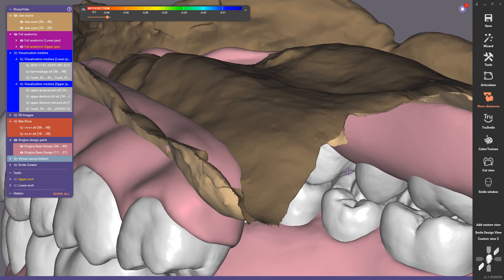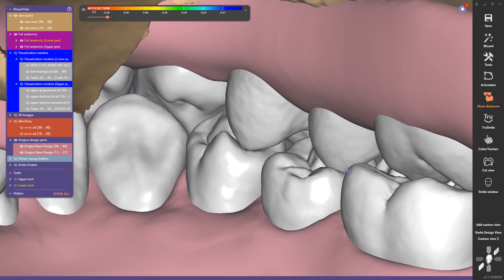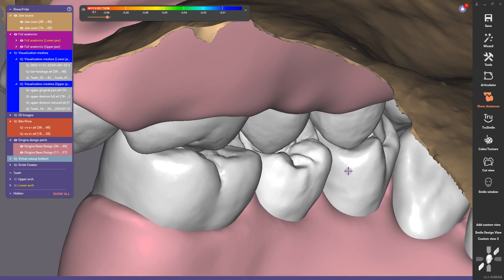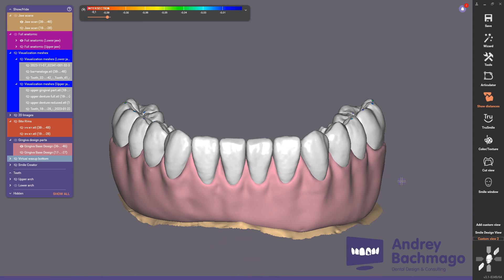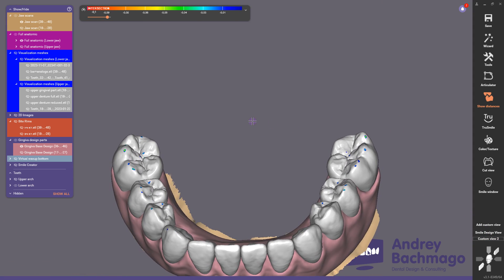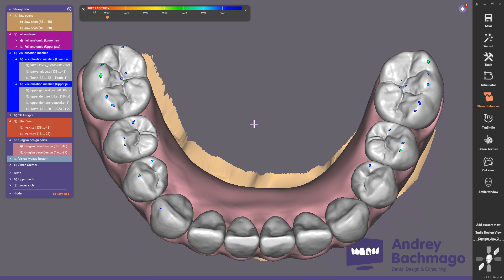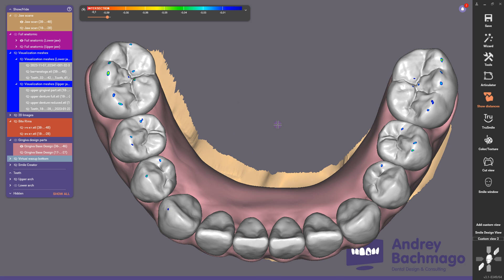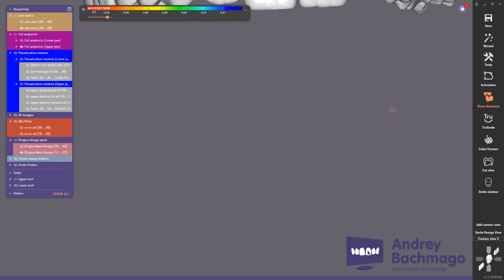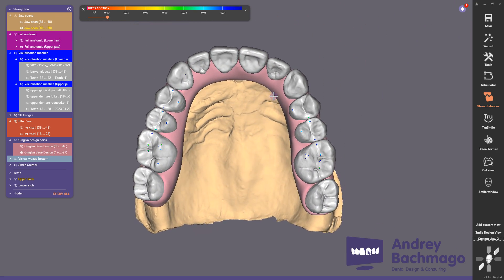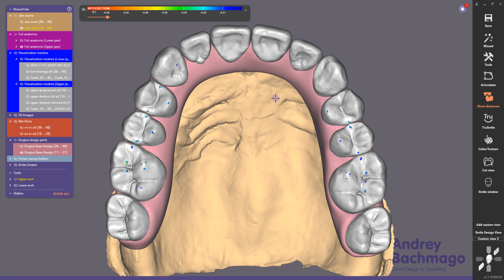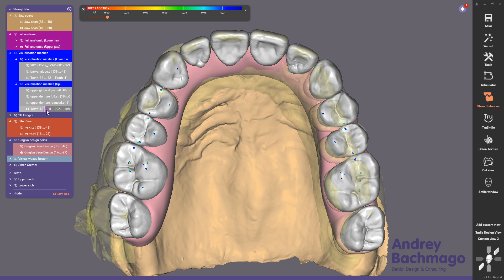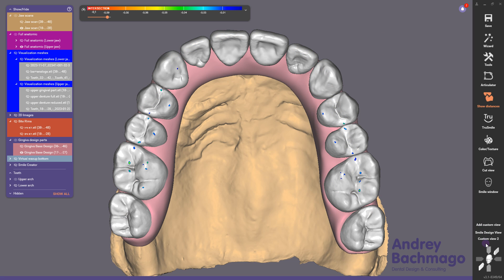Let's check the occlusal view. The contact points and dynamic movements are also prepared using the virtual articulator. The upper scan of the model was asymmetrical, so I decided to follow that asymmetry in this design.